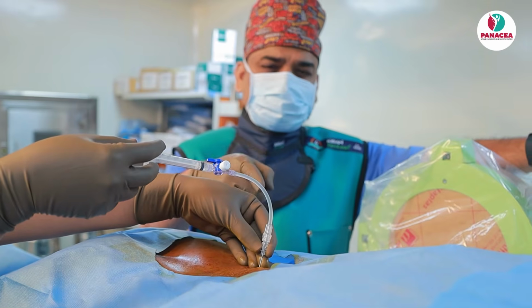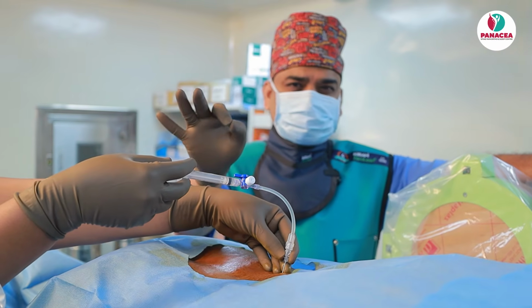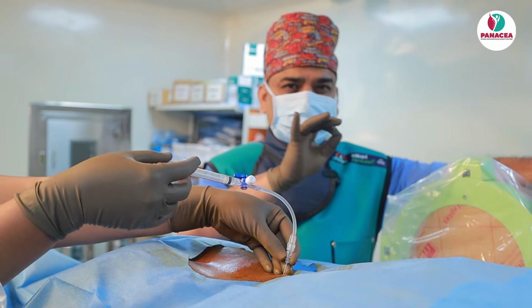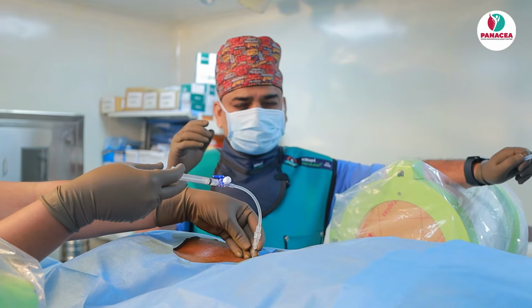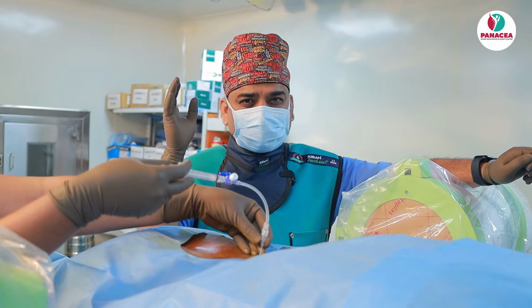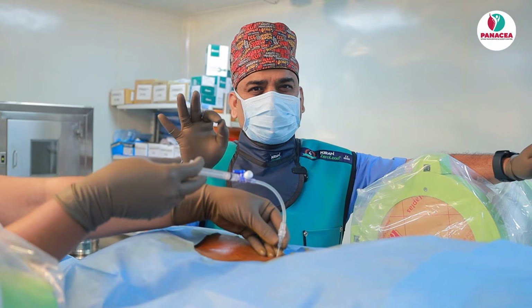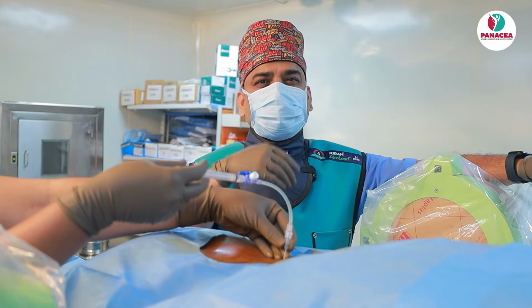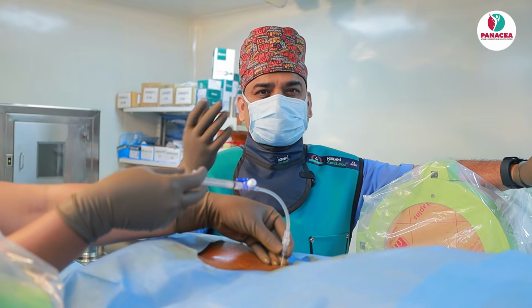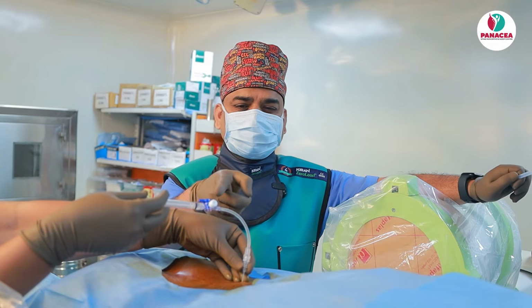An extension line with contrast dye, initially we only inject 0.2 to 0.3 cc and check whether it is in the epidural space. Otherwise, if it is not in epidural space and you inject too much of dye, you cannot redo the procedure at the same level. So the philosophy is just inject 0.2 to 0.3 cc and see that it is in the epidural space. Then if you want to appreciate the structures, you can inject more, 1 to 2 ml, no issue. So you see the extension line.